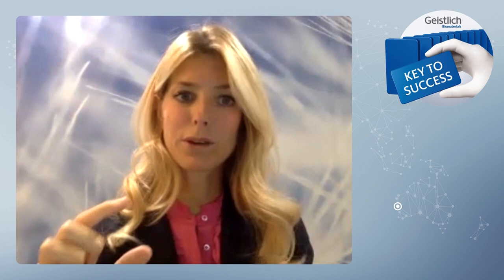Now, what happens with them? It's very simple. You remove it, because obviously you can't leave a screw, because that will probably be the position of your implant. So it is left for the 6 or 9 months of healing, and then it is removed when the implants are positioned, at the same time as PTFE membrane removal: screw removal, implants inserted. That's the protocol.